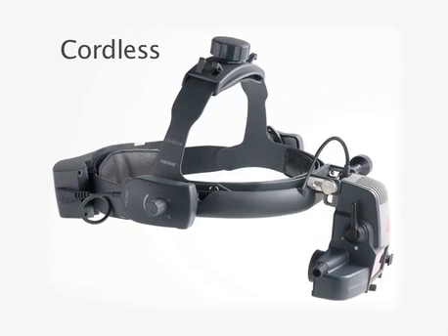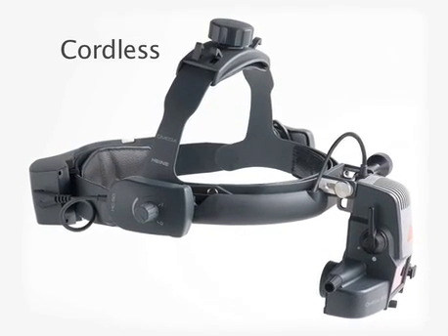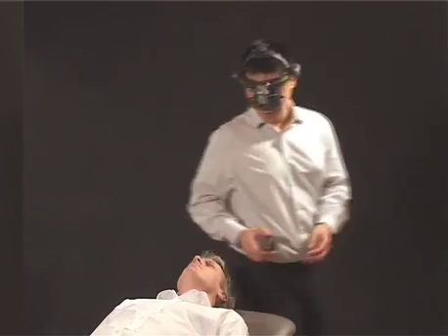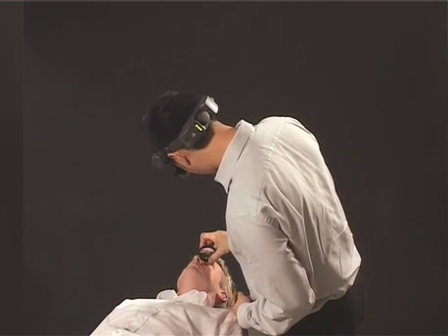Probably one of the most useful practical innovations is the recent development of the cordless instrument. This allows entirely unrestricted mobility of the examiner and does away with troublesome wires and cables that invariably get in the way and can be a safety hazard as well as a distracting nuisance.